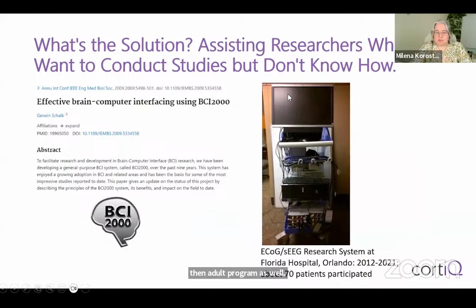It was BCI software, and we used at that time eight g.tec amplifiers. So quite a cumbersome system. I worked with it all the time, and it really was difficult to drag it to our epilepsy monitoring unit and bring it back and assemble and whatnot. So even here already with some software support, the system was still fairly cumbersome.